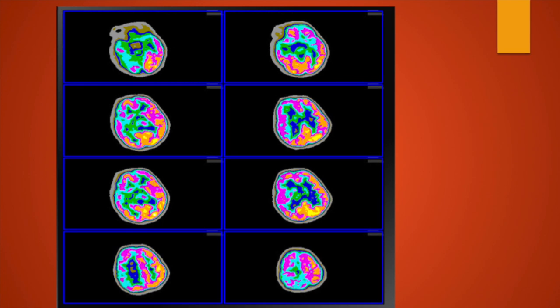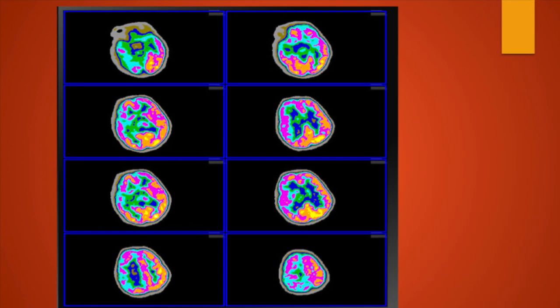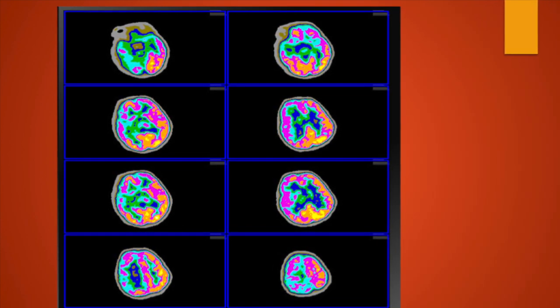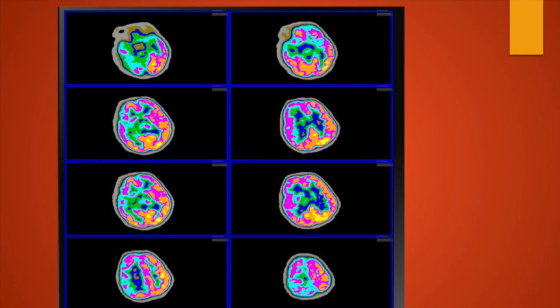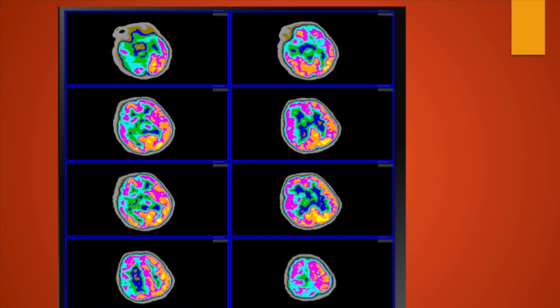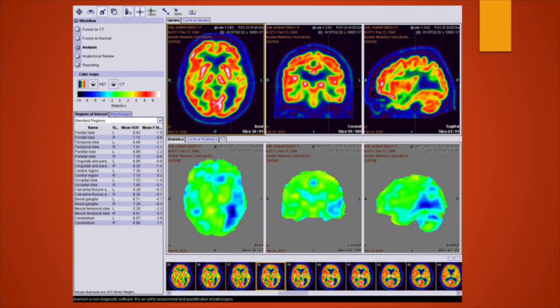The chart also includes temporal lobes, parietal lobes, cingulate areas, central region, occipital lobe, calcarine fissure, basal ganglia, mesial temporal lobe and cerebellum. All regions have left (L) and right (R) values with mean SUV values shown. The disparity in the difference between the right and left is the mean shown in the chart. With the SUV values we can see the disparity between right and left and that is how you can easily identify the metabolic activity of the cerebral cortex.